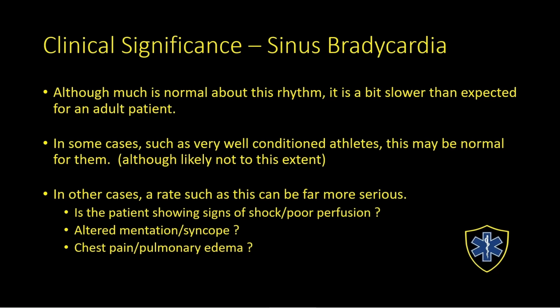Now, on the other side of the coin, if this patient is a 50-year-old male couch potato who's 110 pounds overweight and experiencing chest pain and difficulty breathing and having trouble keeping their eyes open, that would be very, very clinically significant. So again, evaluating sinus bradycardia, yes, it can be normal, it can be abnormal, and so much has to do with actually evaluating the patient's presentation far more than you can get by just looking at an EKG strip.